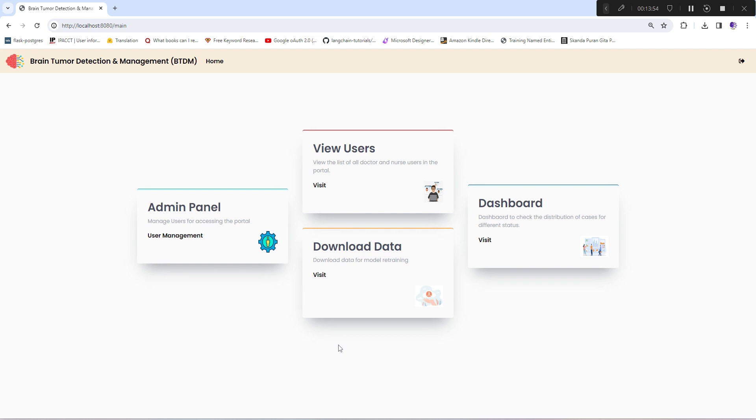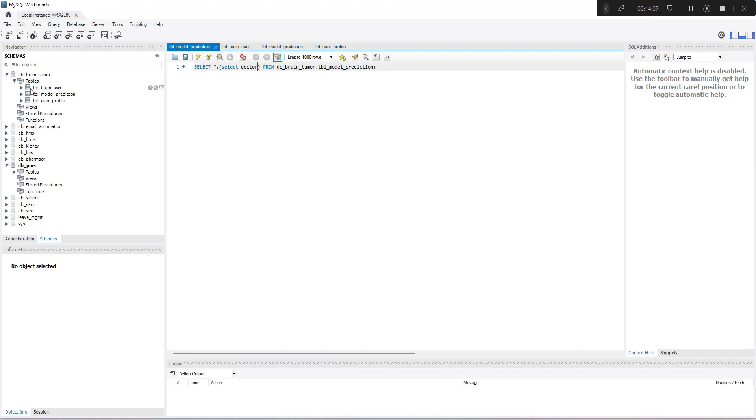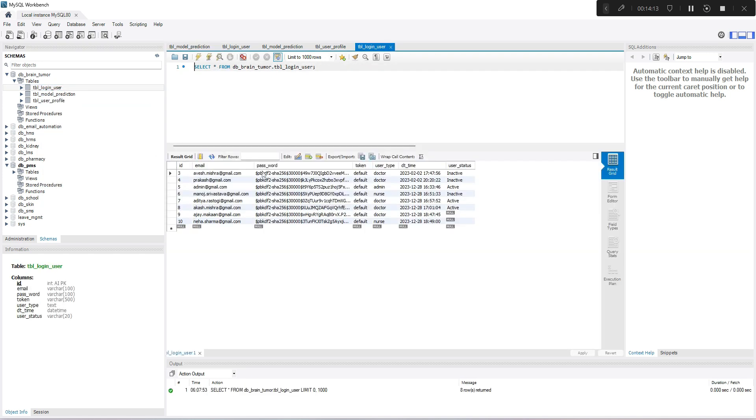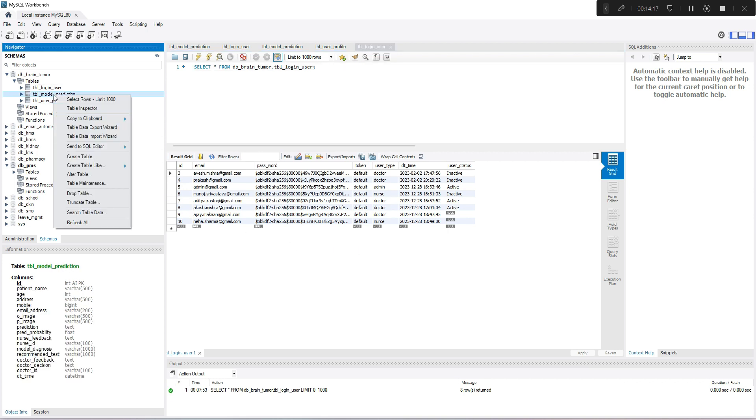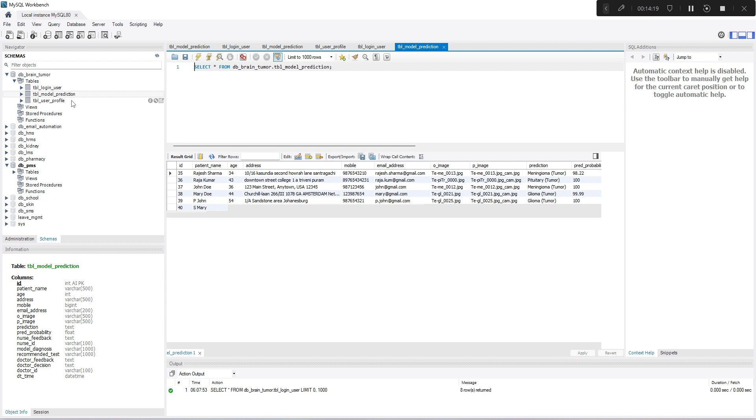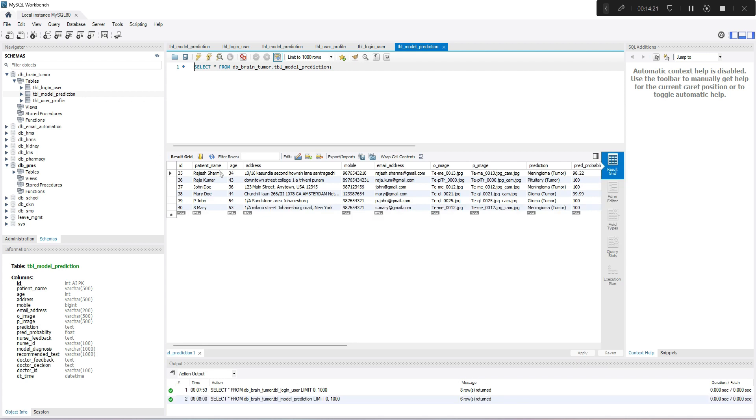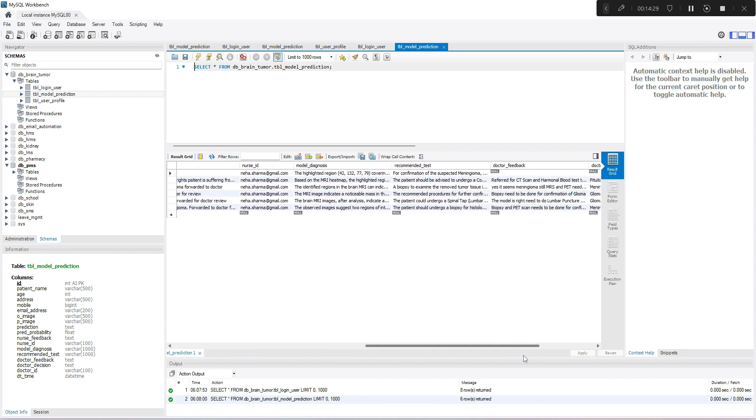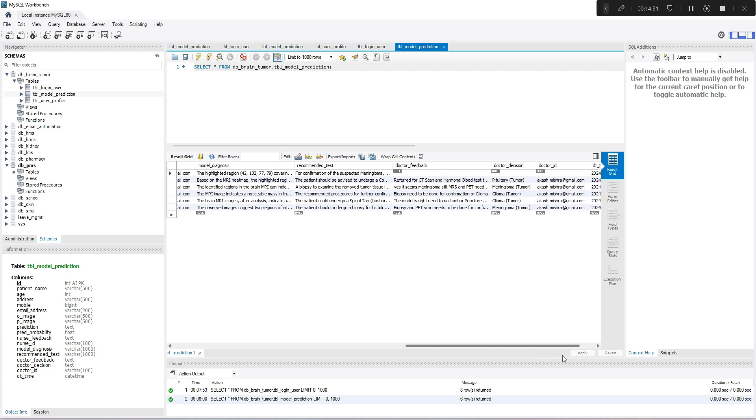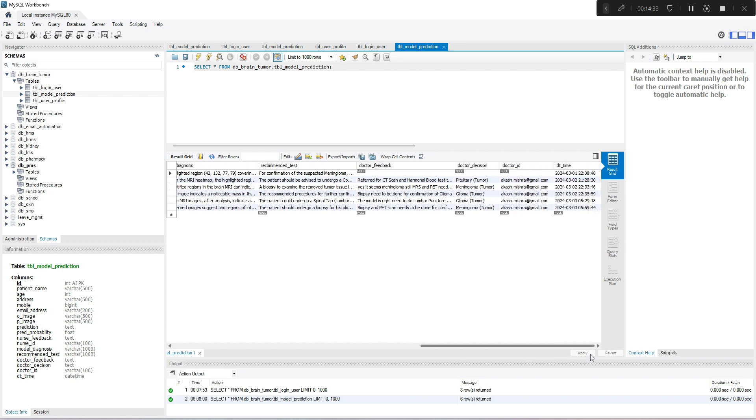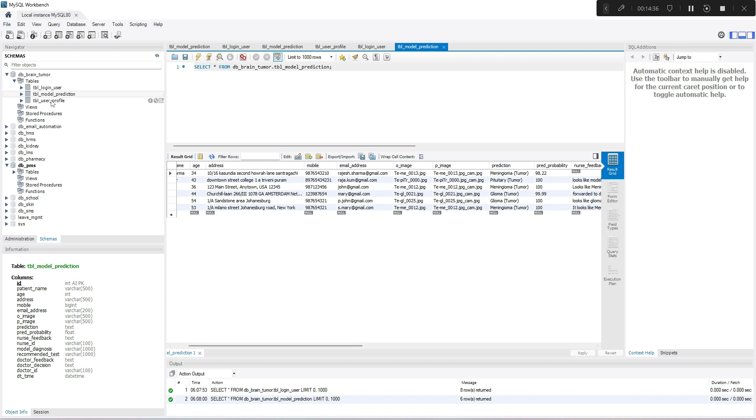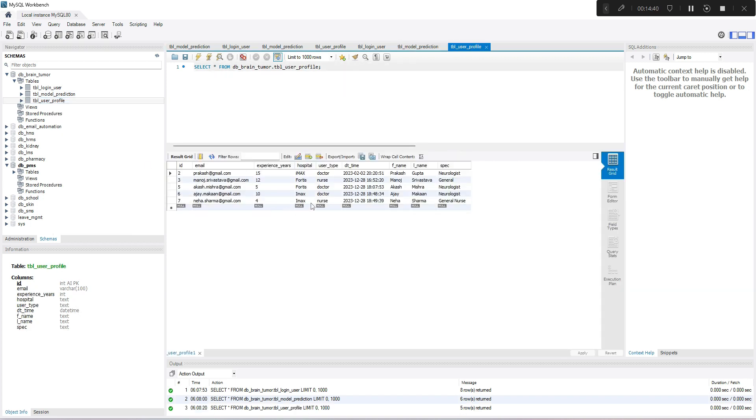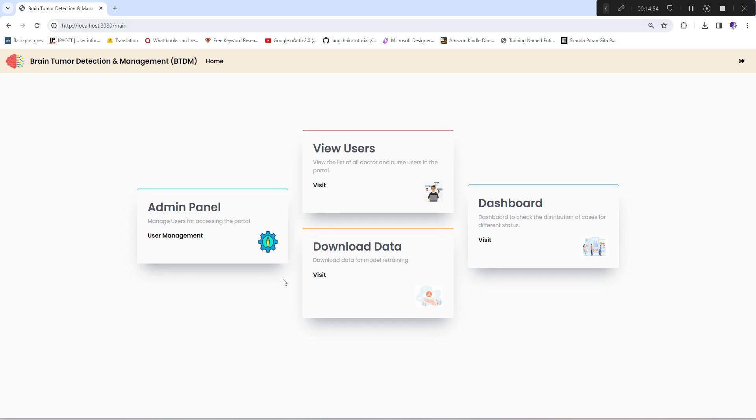I've used heat maps to show the highlighted affected region. To store all the details, I've used MySQL database. These are some of the tables: tbl_login stores all login details of users, tbl_model_prediction captures patient details, uploaded image, prediction, nurse feedback, model diagnosis, recommended tests, doctor's feedback, doctor ID, and date. The last one is user_profile - doctors and nurses can change their profiles and this table will be updated and shown to them in the panel.